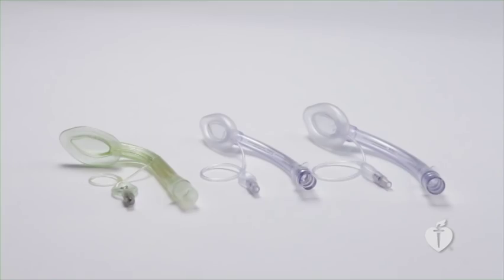The laryngeal mask airway is a supraglottic airway device consisting of a tube with a distal inflatable mask. It is inserted blindly into the hypopharynx and it sits above the glottis. It can be inserted without interruption of chest compressions. Laryngeal mask airways are available in a variety of sizes.